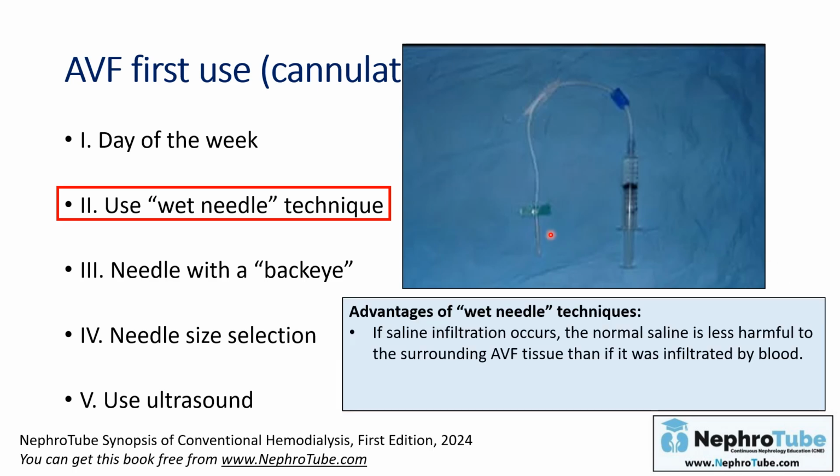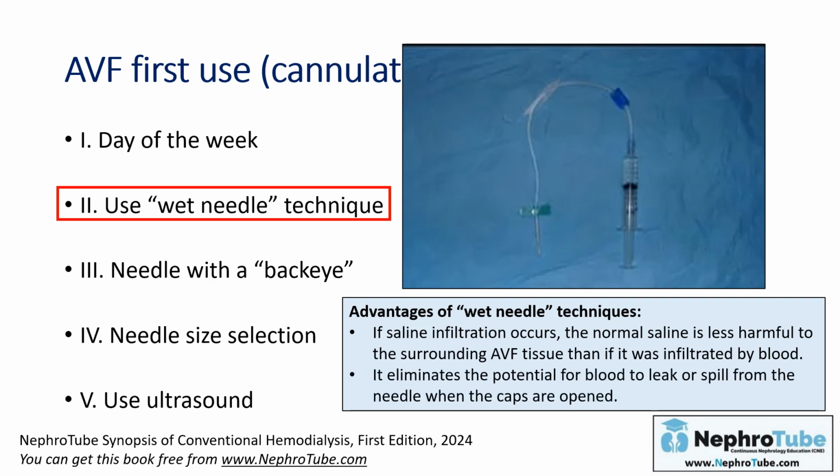If infiltration occurs with saline, the saline is less harmful than blood to the fistula and surrounding tissue, and it is easily absorbed, by the way. And also, the use of this wet needle with saline eliminates the potential for blood to leak or spill from the needle when the caps are opened, so it is safer for the patient and the working staff.